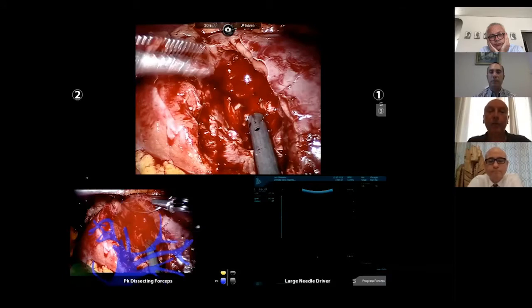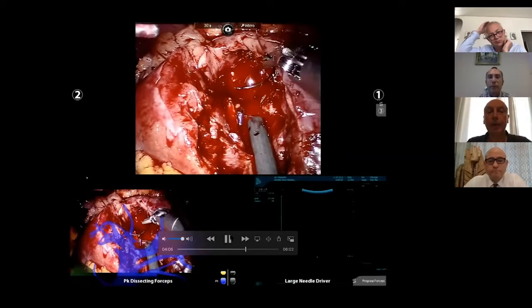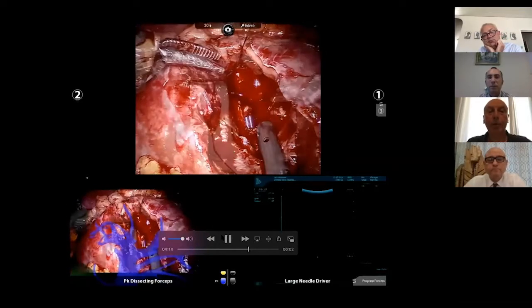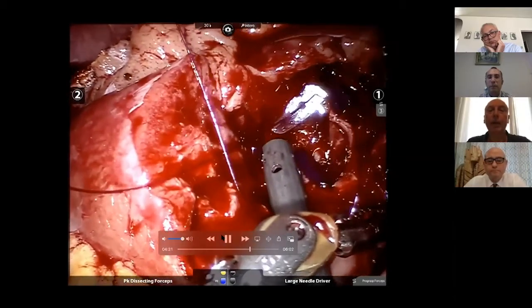preventing in this way an arteriovenous fistula, and preventing the possibility of involving the big intraparenchymal arteries. So we can prevent the risk of creating a renal injury and postoperative complications, and this is in my opinion another of the advantages of this technique. I continue with the suture on the intraparenchymal part, and the superficial suture is guided by the augmented reality. Usually the suture is stopped and secured by the absorbable lock.